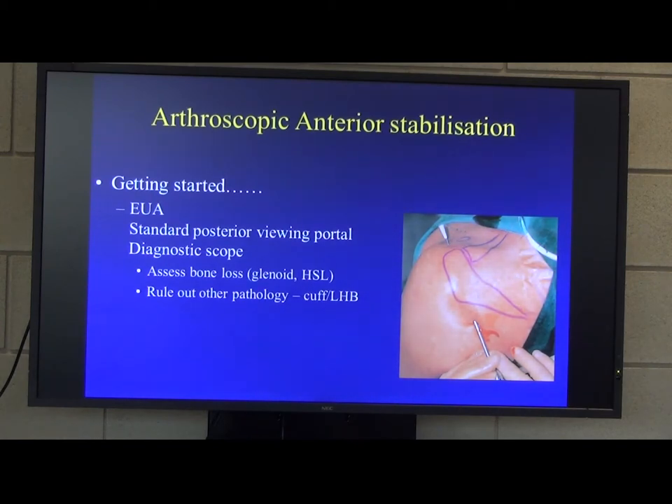Go through a standard posterior portal, do a diagnostic scope, and have a look at how much glenoid has been eroded from the front of the glenoid and how big the Hill-Sachs lesions are at the back. I tend to CT all of my patients prior to stabilisation surgery to quantify that, because it's probably a more accurate way of doing it.